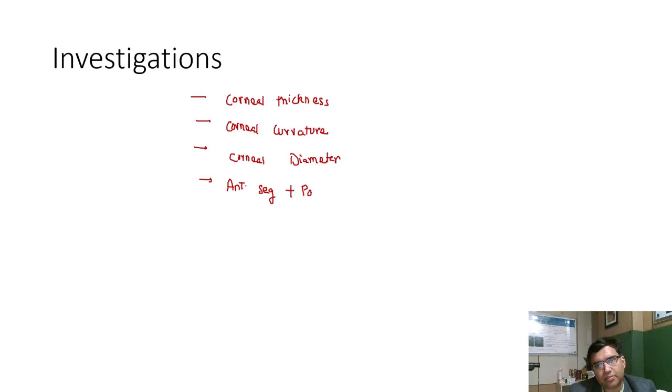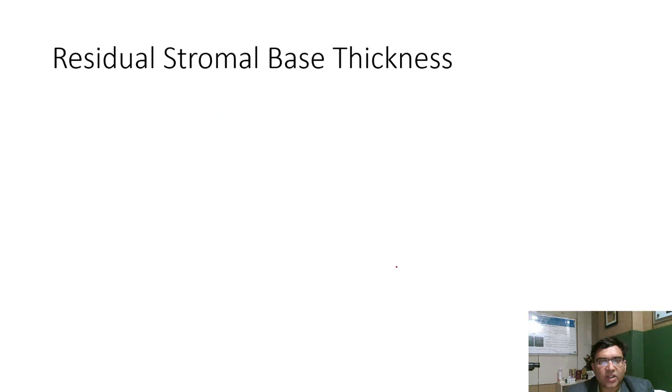A very important instrument which can basically take care of all the corneal investigations like corneal thickness, corneal curvature, corneal diameter is called Pentacam. Okay, so if they ask the investigation of choice for any corneal ectatic disorder or LASIK, your answer is Pentacam.